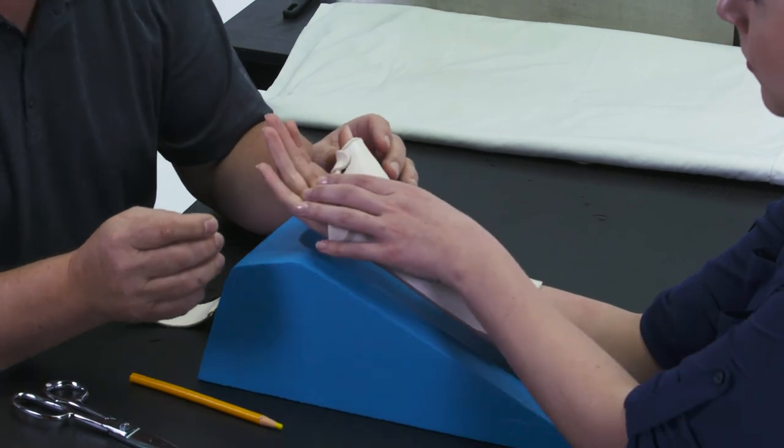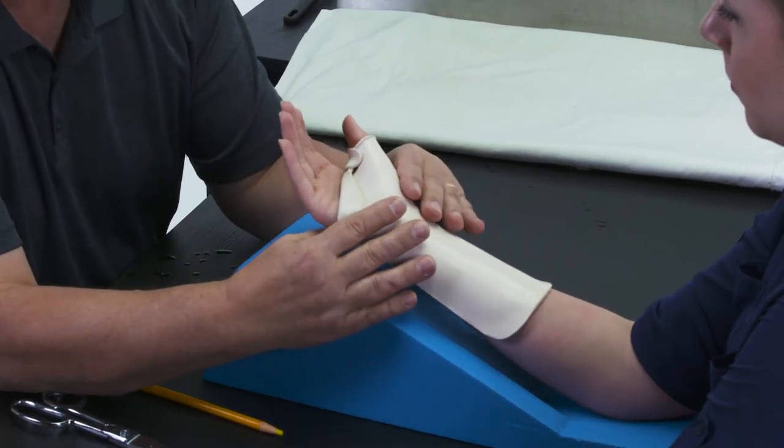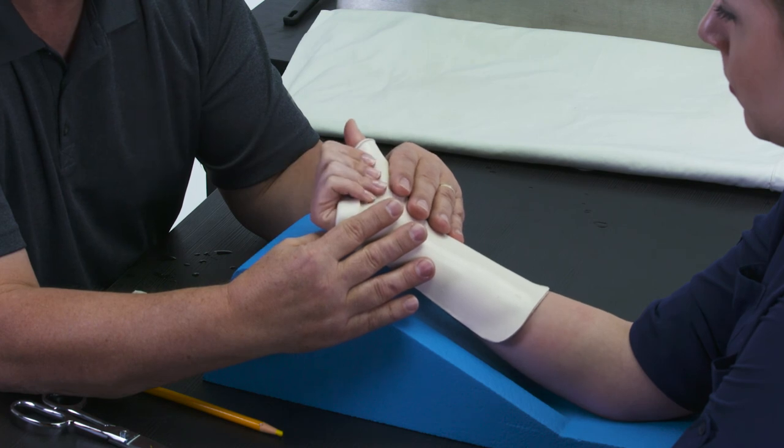Place splint on patient's hand, making sure the IP joint of the thumb and the MPs have free range of motion.